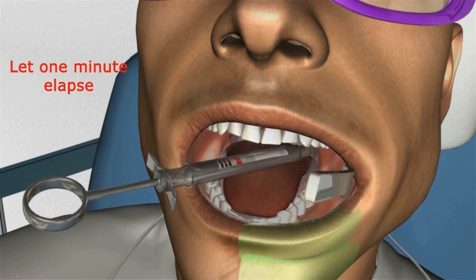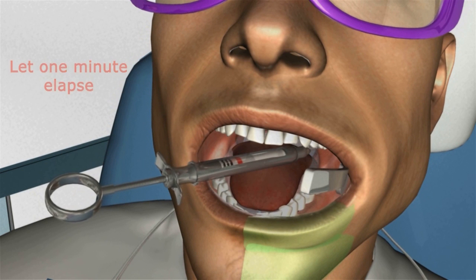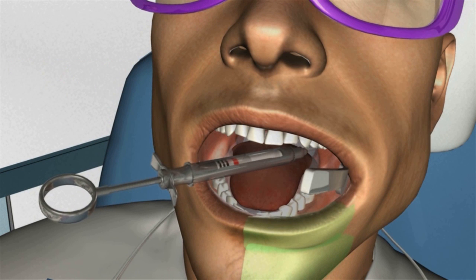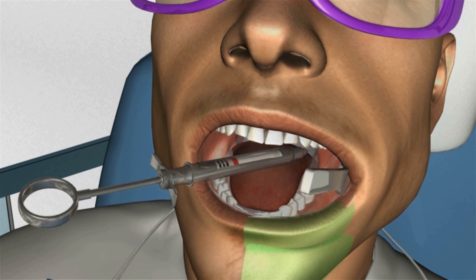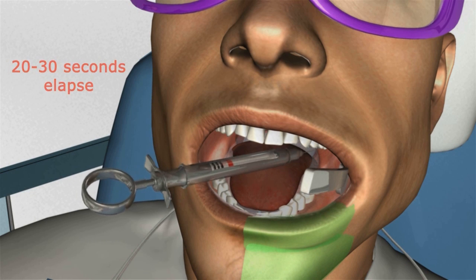Once you have deposited the necessary amount of anesthetic, approximately 1/2 to 3/4 of the carpule over 1 minute, withdraw the needle half the distance of the penetration. Apply a single aspiration test, and if negative, slowly deposit the remaining quarter to a half of the carpule for the lingual nerve block over 20 to 30 seconds. After completing the lingual nerve block, withdraw the entire needle and recap with the one-hand technique.